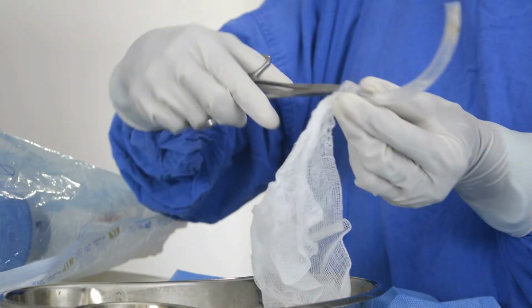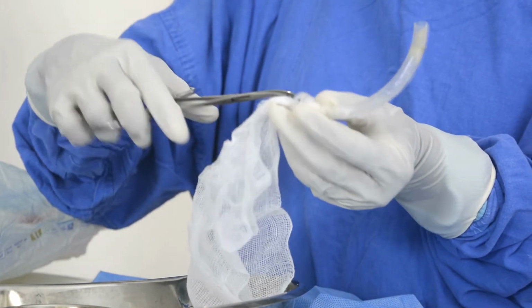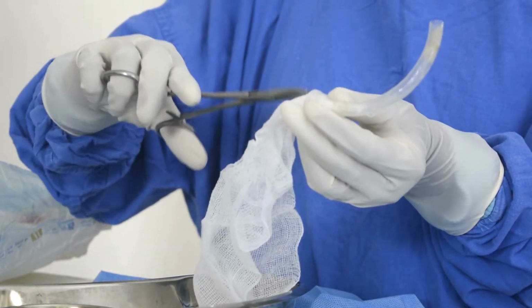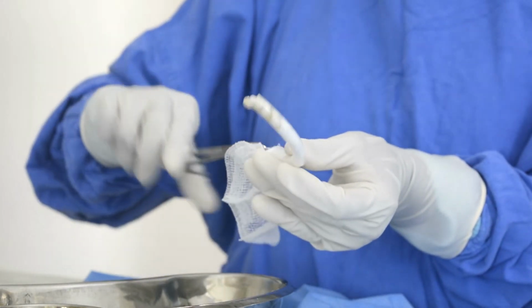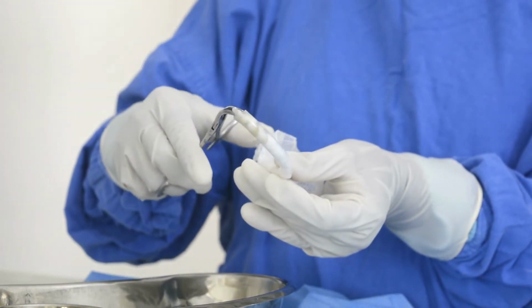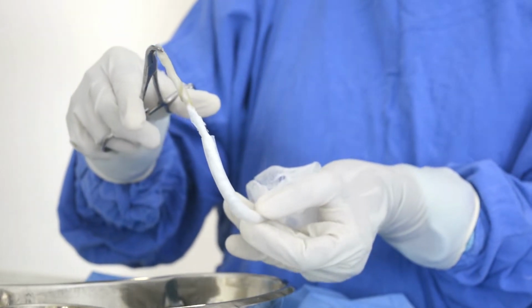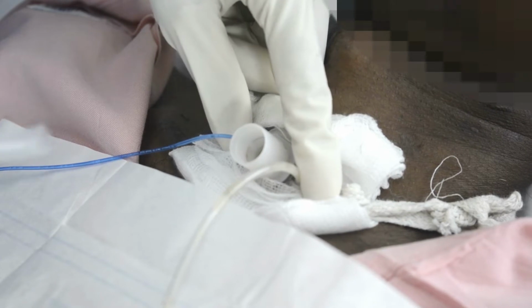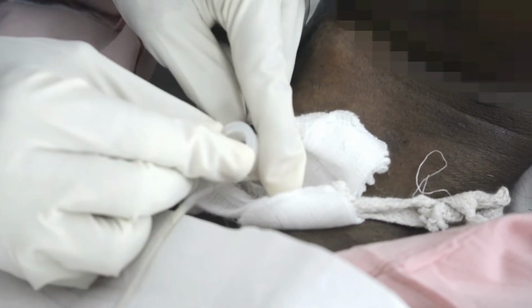Then clean the inner cannula with sterile gauze. Dried gauze is used for this, or roller gauze. If a brush is available, we can use that. Otherwise, clean the inner cannula like this. Again, reinsert carefully in this fashion, stabilizing the tracheostomy with the other two fingers.